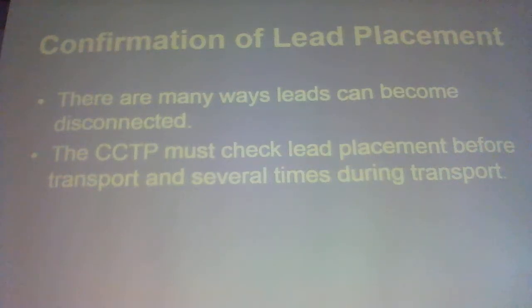So, this is kind of a no-brainer, but you need to check your leads to make sure that they stay on. So when we get our V-fib alarm, we don't immediately shock them, we check them out first. Right?